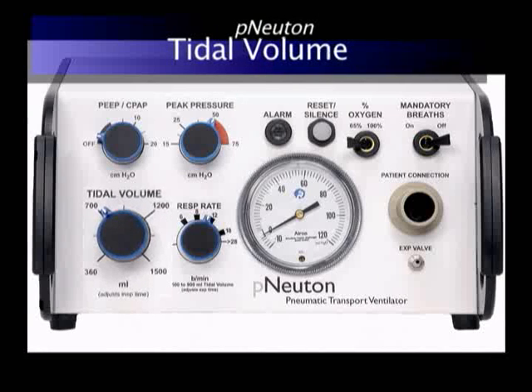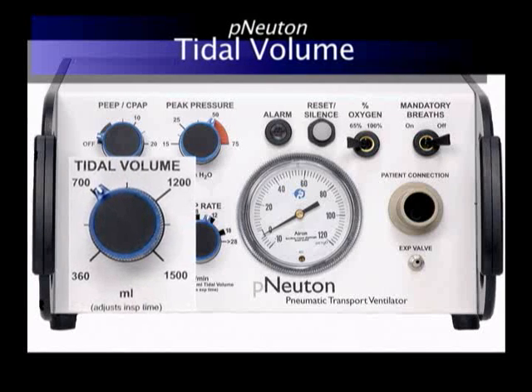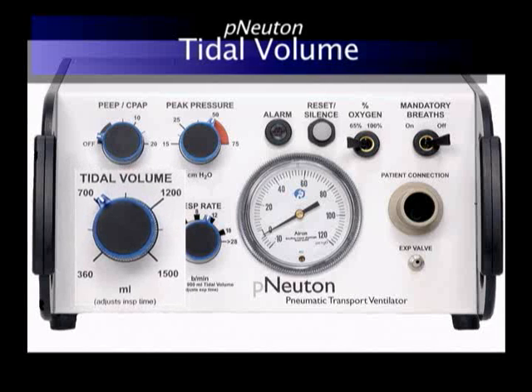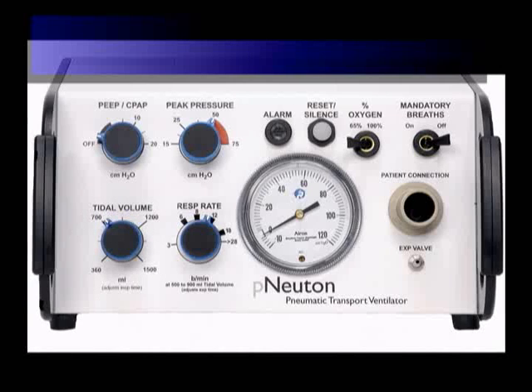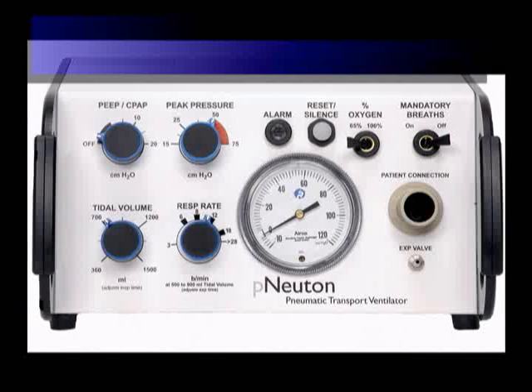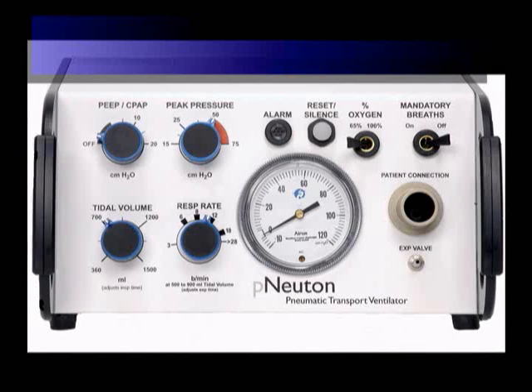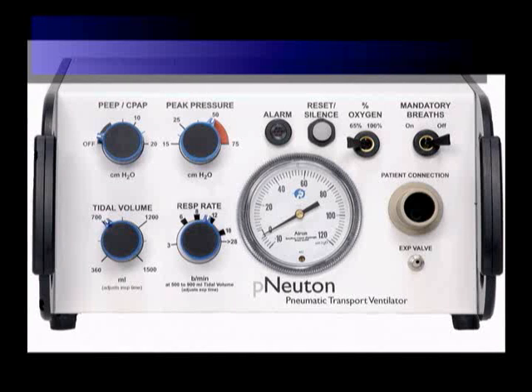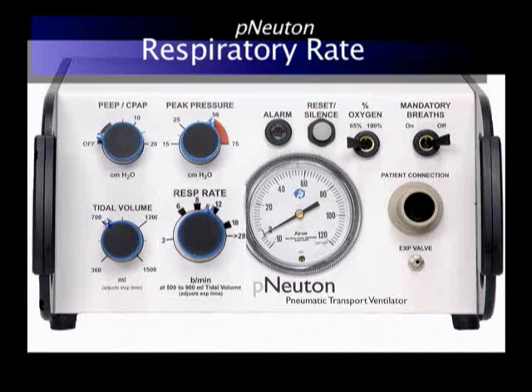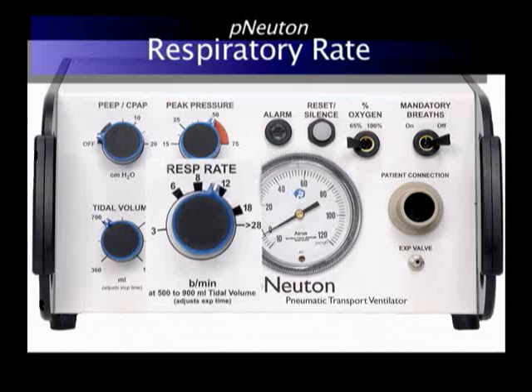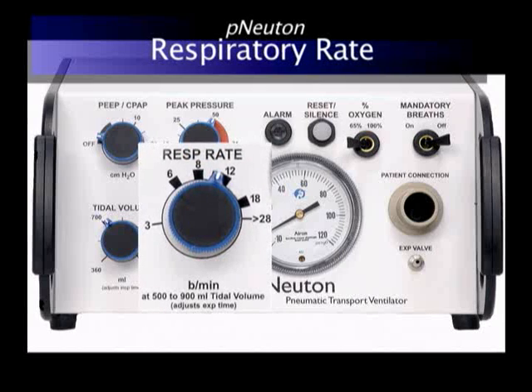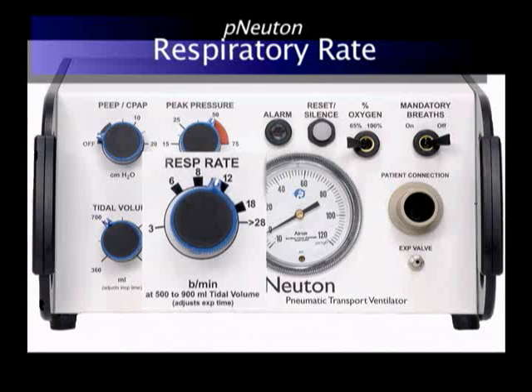Here you see the tidal volume control. It has a range of 360 to 1500 mLs for pediatric and adult patient needs. The Newton uses a preset flow at 36 liters per minute. The tidal volume has been calibrated for patient delivery independent of changes in patient condition.